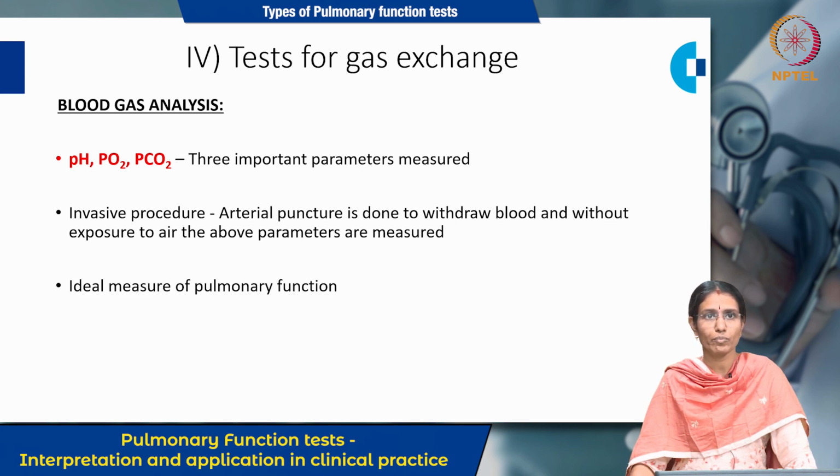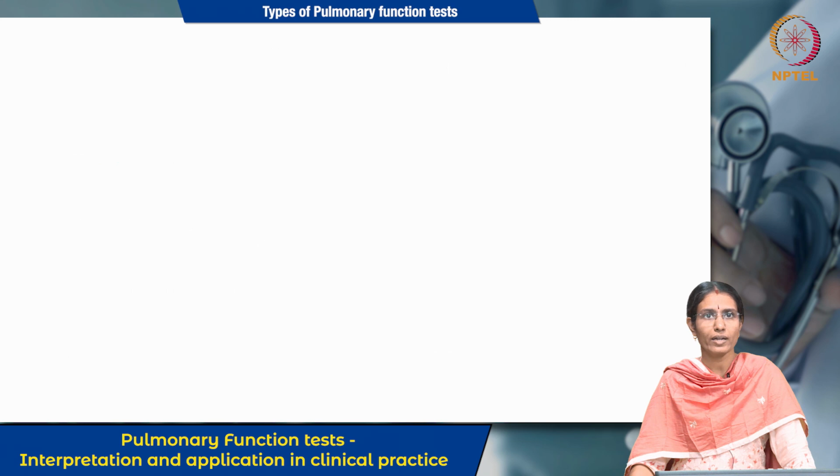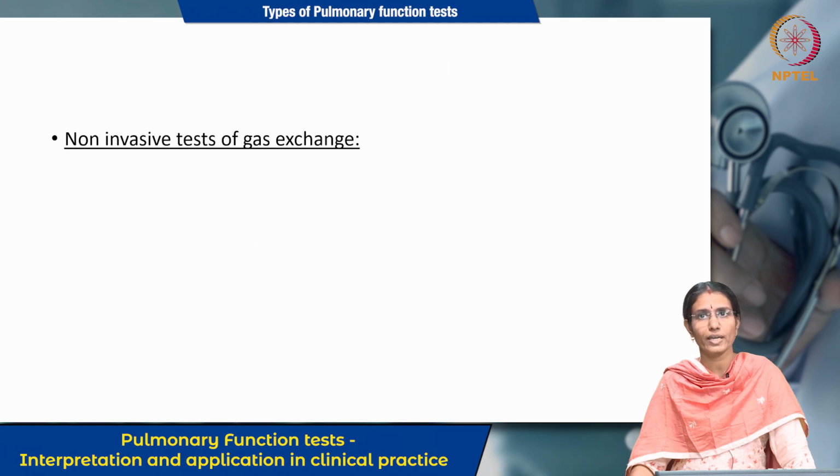So, it is a cumbersome procedure too. But this is an ideal measure of pulmonary function, because it assesses the 2 important functions of the lung, being oxygenation and carbon dioxide removal. Are there any non-invasive tests to measure the gas exchange?